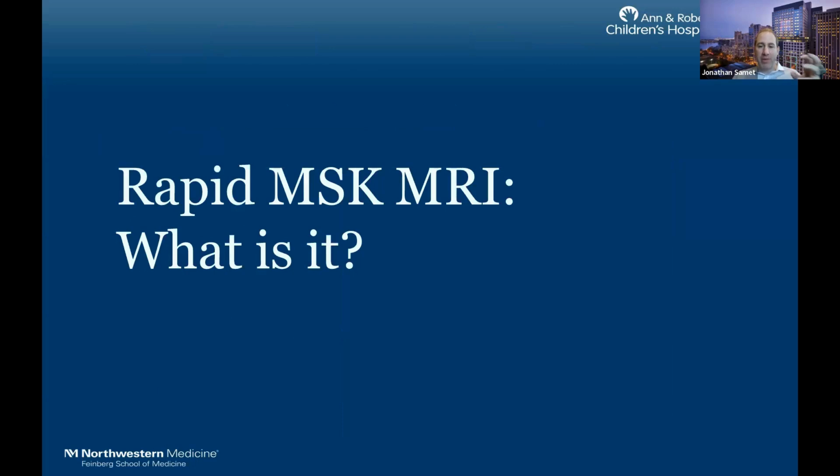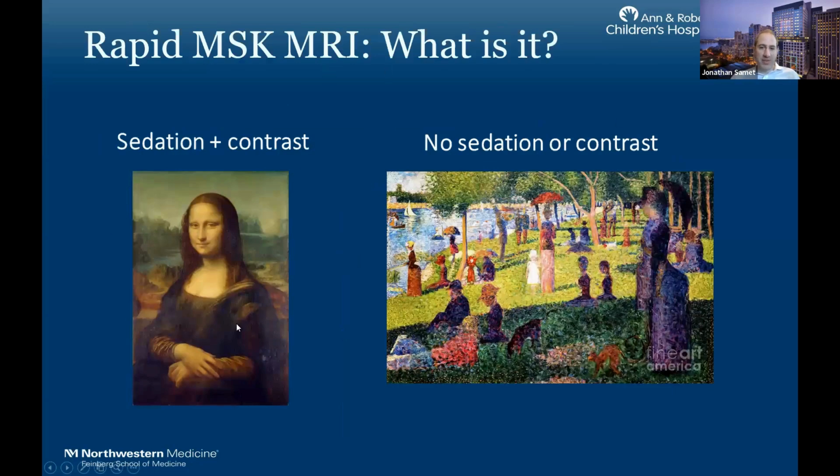So what is a rapid MSK? Now you're going to say, well, he's been talking about this whole time, what actually is it? There are probably a lot of different varieties of things you can do. This is an example I use in my mind when I explain this to people. If you do sedation and contrast, you get the Mona Lisa, right? Beautiful picture, very crisp image, very clear.